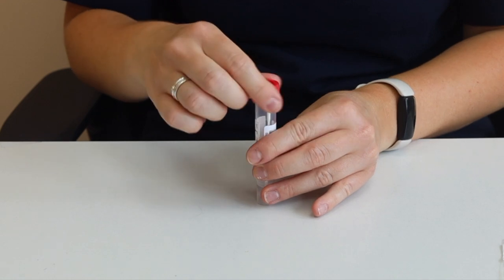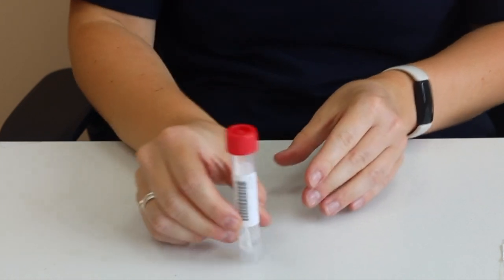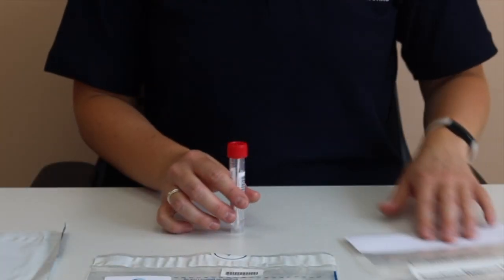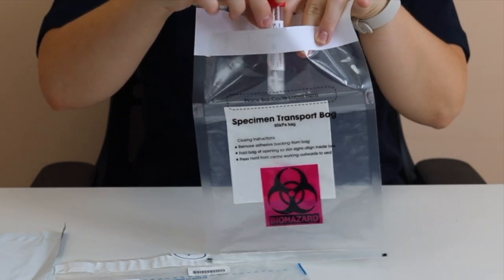Securely screw the lid back onto the tube. It's very important the lid is screwed on tightly so that the liquid does not leak. Place the tube into the biohazard bag and seal it.